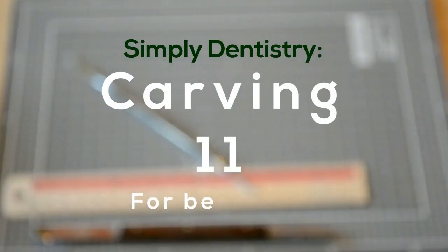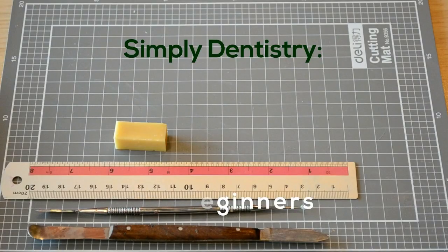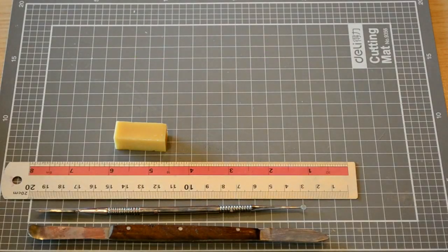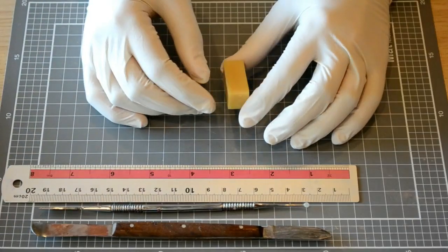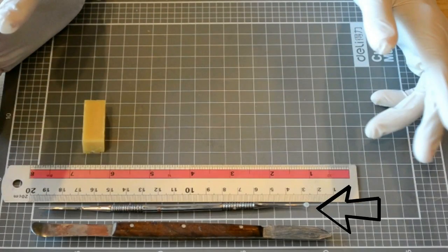Hi and welcome to single tooth carving for beginners. In this video we'll be teaching you a basic carving method for the maxillary central incisor with some useful tips and tricks for carving. What you'll need is a wax block, a lecron carver, a wax knife, and a ruler.